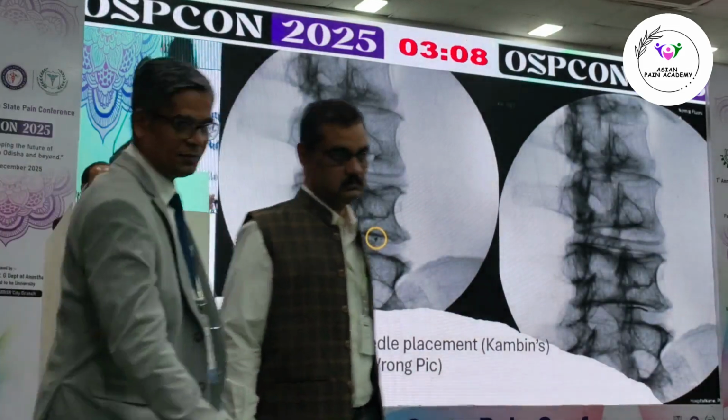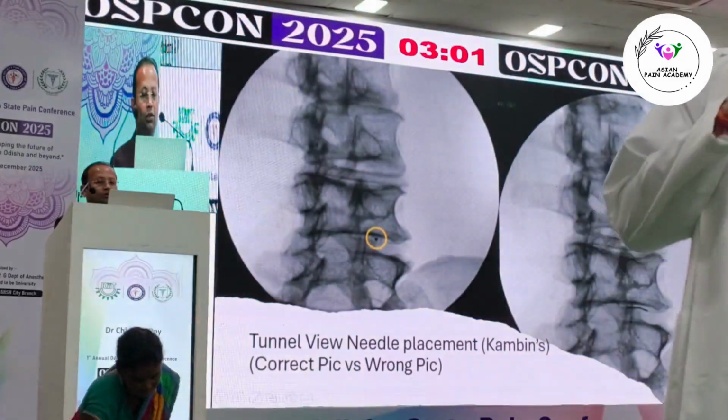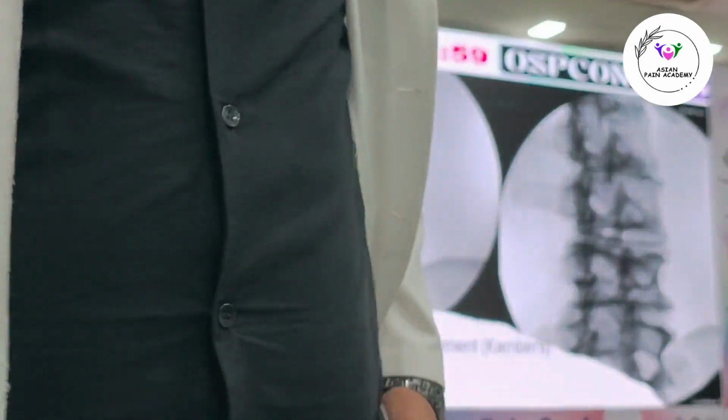So this is called tunnel view. Always this procedure is a tunnel view approach. So this is non-tunnel view and this is tunnel view.